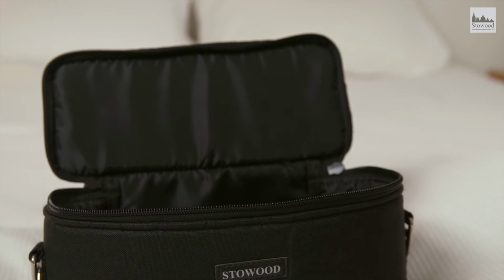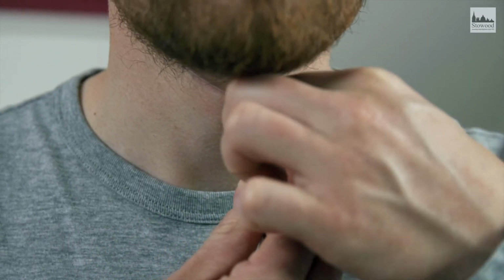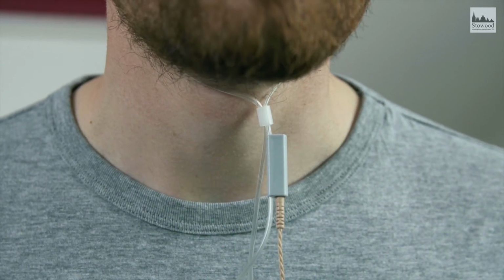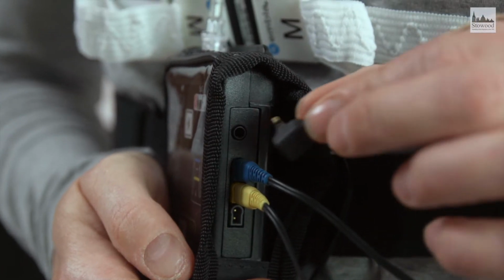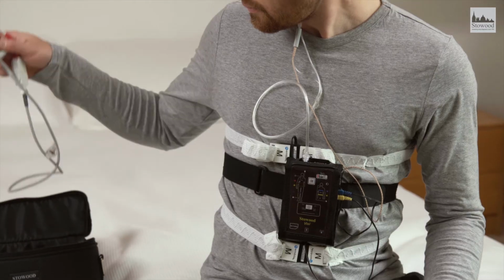Fit the microphone body to the nasal cannula by pressing the microphone to one of the 2 thin tubes of the cannula just below the little plastic sliding collar. Plug the microphone into the sleep recorder. Next, we'll fit the oximeter sensor.